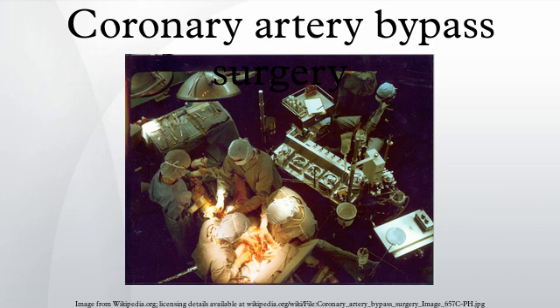One end of each graft is sewn onto the coronary arteries beyond the blockages and the other end is attached to the aorta. The heart is restarted. Or in off-pump surgery, the stabilizing devices are removed. In cases where the aorta is partially occluded by a C-shaped clamp, the heart is restarted and suturing of the grafts to the aorta is done in this partially occluded section of the aorta while the heart is beating.